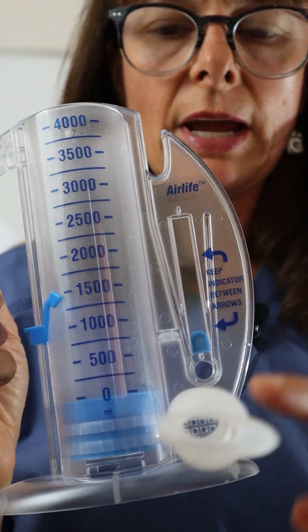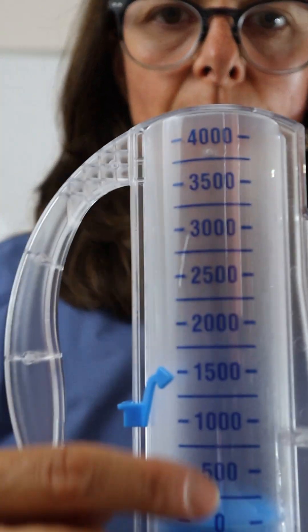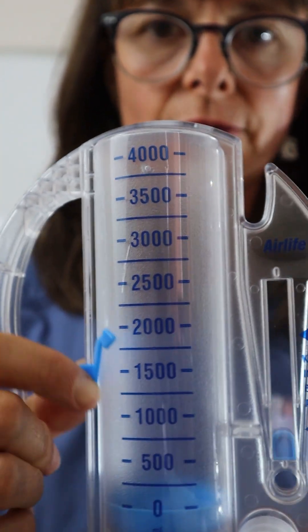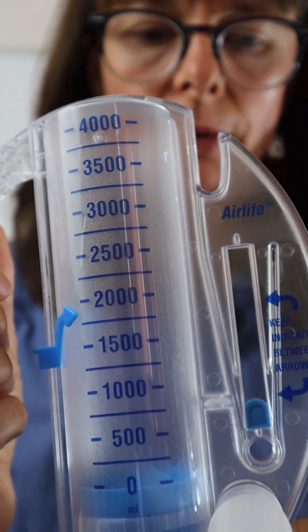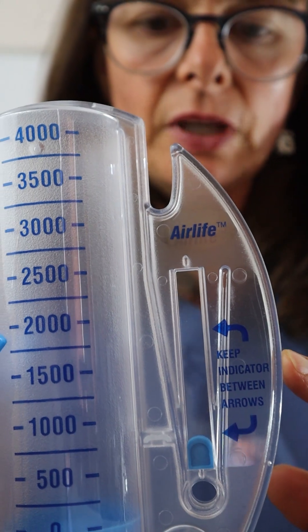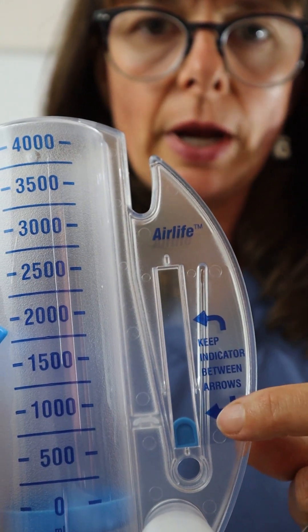Here is what a close-up of the incentive spirometer looks like. We have the mouthpiece right here, and then we have the chamber that lets us adjust the volume for what we want the patient to be able to inhale. Over here we have the gauge — we always want to make sure we keep that gauge between the two arrows.